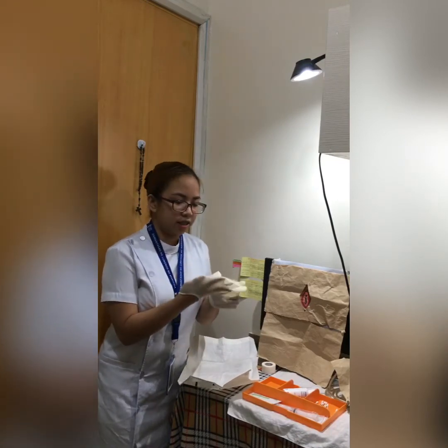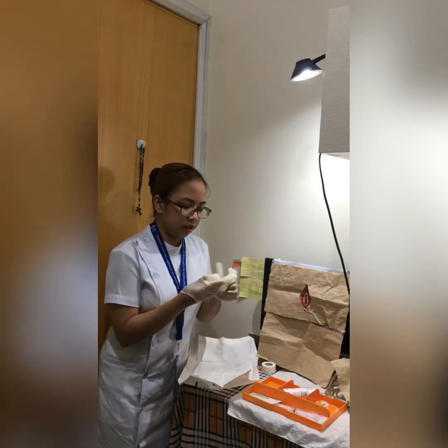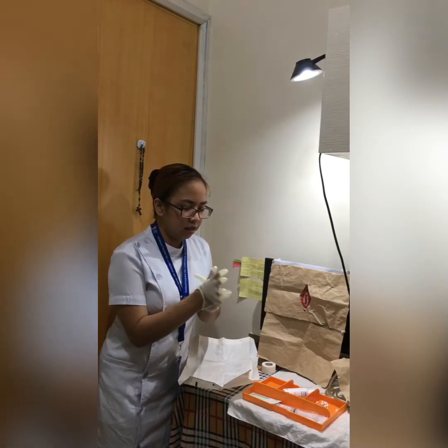Now I can adjust the gloves because both gloves are on.